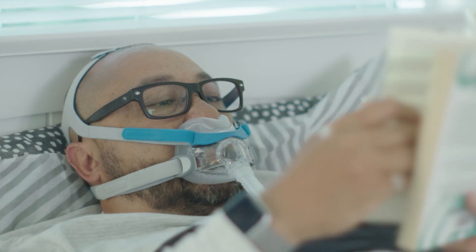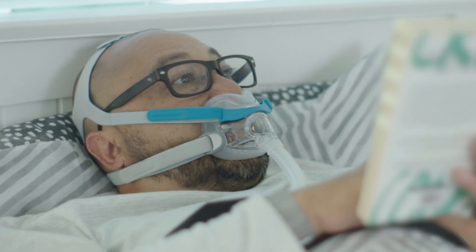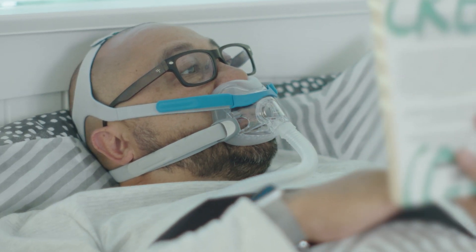It also opens up the field of view. You haven't got anything encroaching on your vision, and it allows you to wear glasses while wearing the mask.